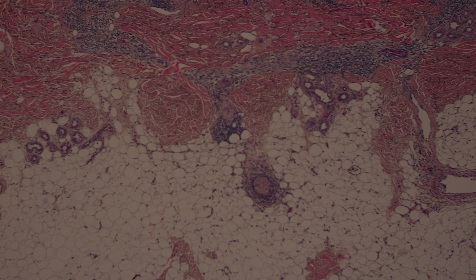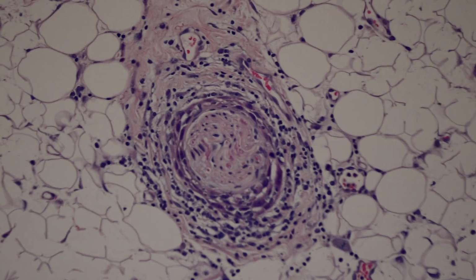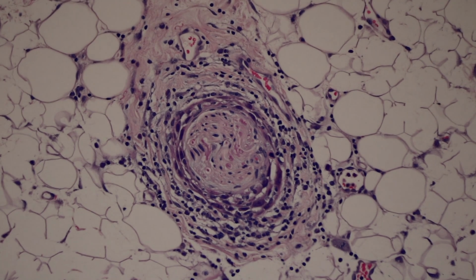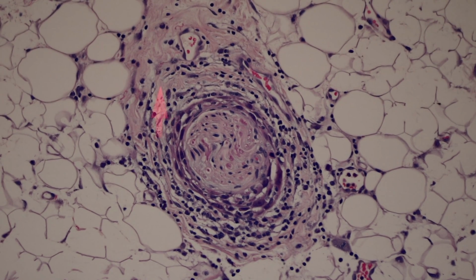We see an inflamed nerve. An inflamed nerve, or a nerve with a lot of myxoid change, should always raise concern that maybe there's perineural invasion in that nerve. And indeed, that's exactly what's happening here. You can see the little nerve, and it's completely wrapped and surrounded by malignant keratinocytes. So there's perineural invasion, and then note all the inflammatory change around the nerve.